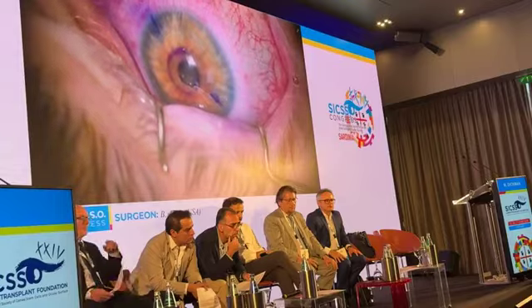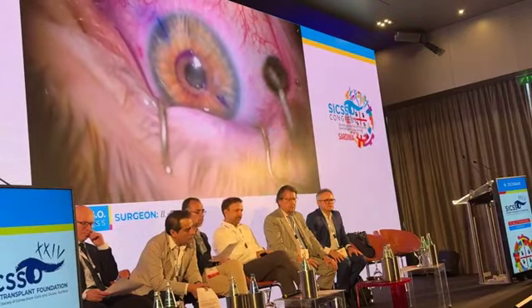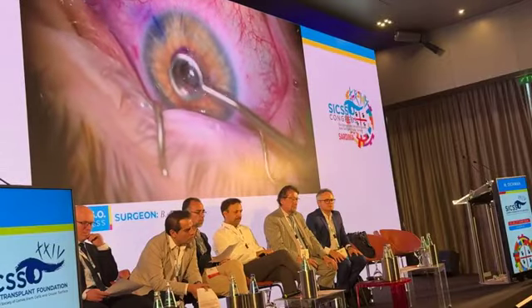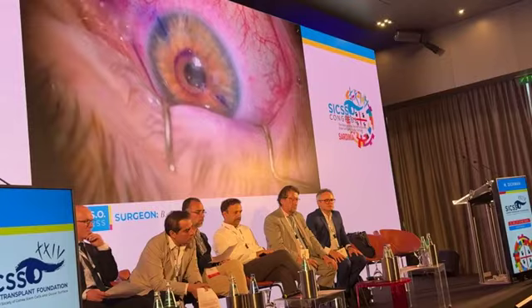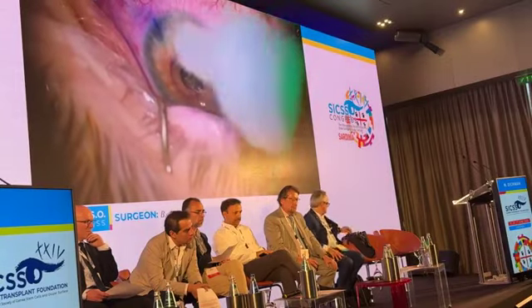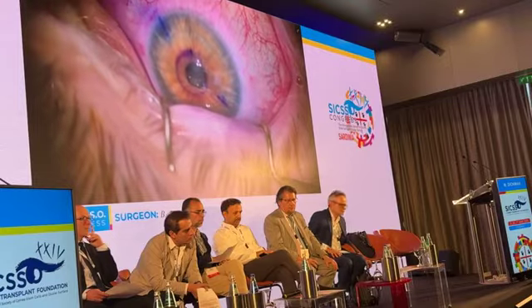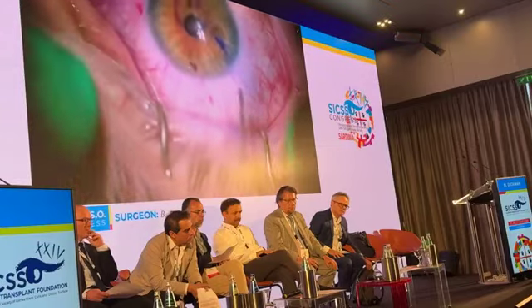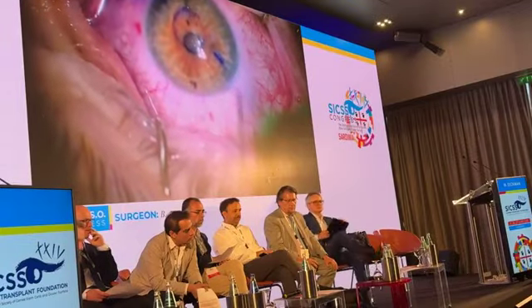That gave us the marks to where we're going to recenter our treatment. The little purple circle you see is just the 4 millimeter optical zone. That shows us the offset from where we made the channels, and the 150 degree axis is already measured. All right, look down just a little bit for me, Hunter. Thank you. Now let me just turn the display on.